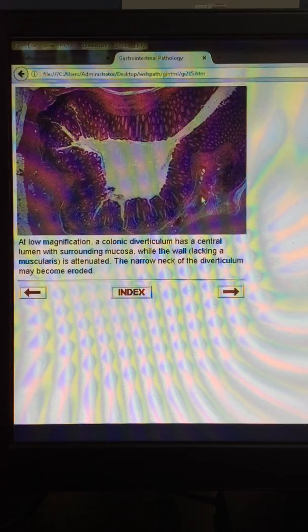Histological examination will show the normal colonic mucosa. This is the neck of the diverticulum, which frequently gets ulcerated due to friction with the fecal material, and the mucosa here is directly adjacent to the subserosal fat and fibrous tissue and devoid of muscularis propria.